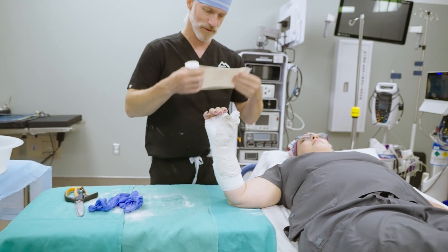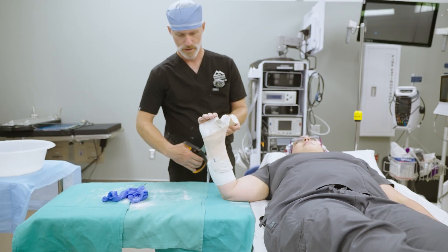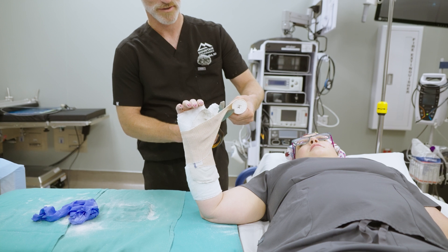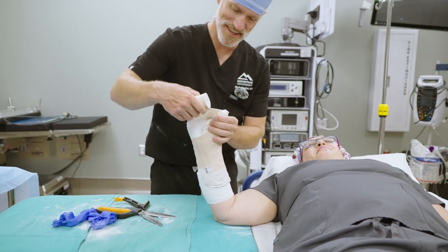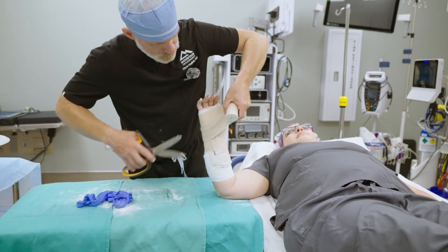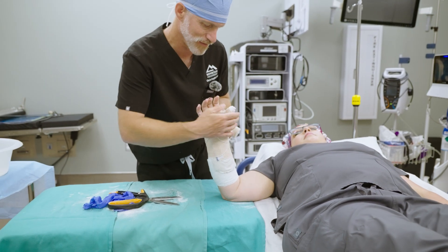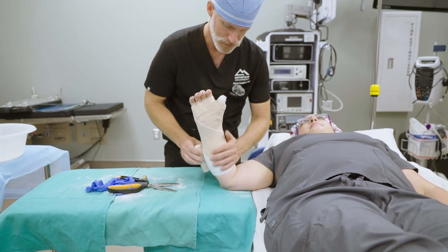The way I wrap this up with the ace wrap: I take a four-inch ace wrap, go around, and then at the thumb I'm going to cut a slot. Then I'll come through here, and as I come back this way, I'm going to cut a long slot that will accommodate the thumb. There we have the ace wrap covering that all the way, tidying the whole thing up. We'll wrap up the rest of it.